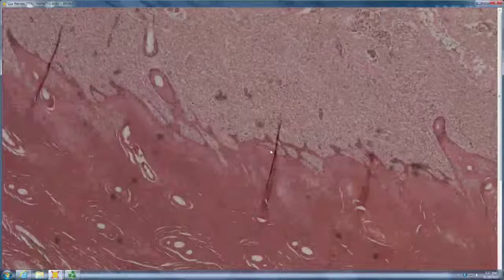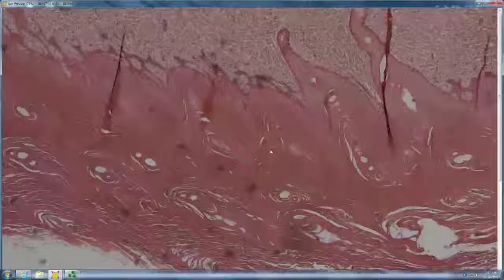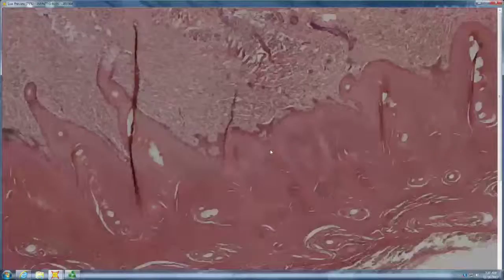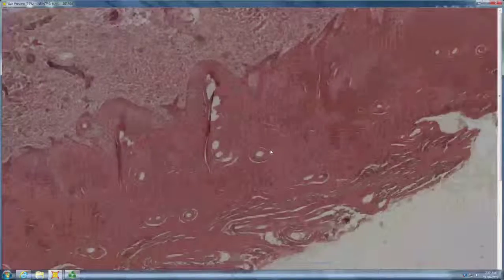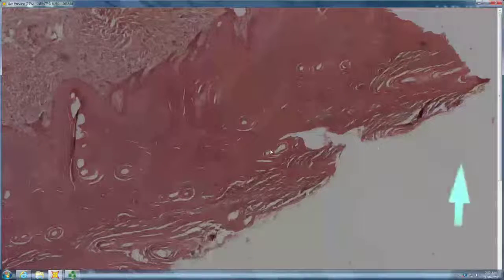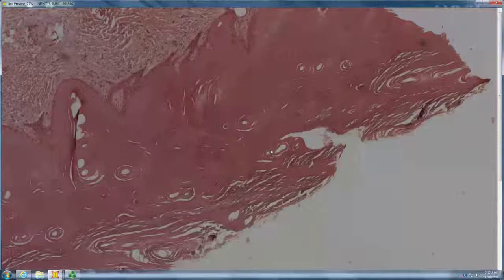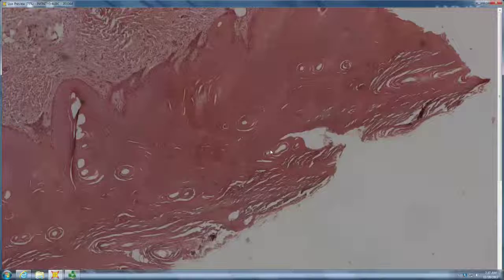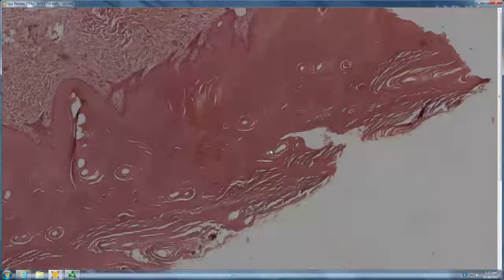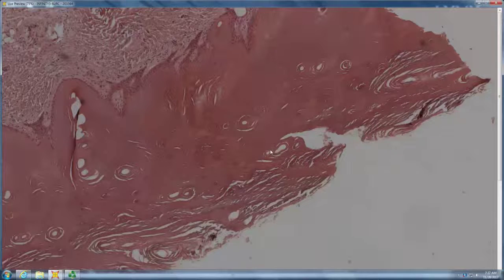Scale is parakeratotic. Adherent hyperkeratosis is orthokeratotic. So this would probably be adherent, very, very thick, and you can even see areas where it's fissured. So it'd be thick fissured plates. This is pretty typical for what you see with a harlequin fetus. So just massive hyperkeratosis, and the whorled keratin pattern is pretty typical.